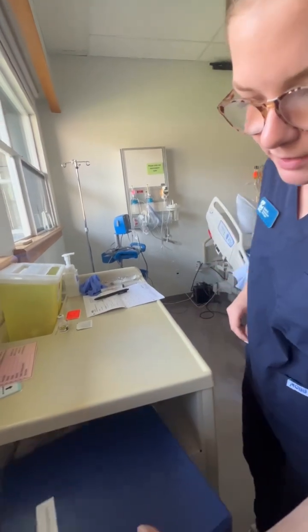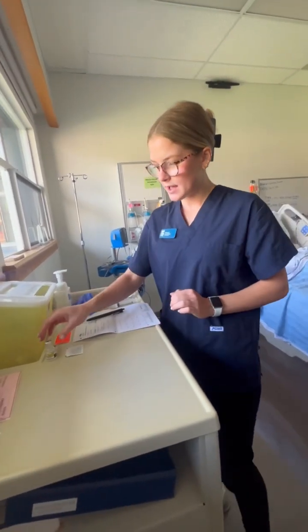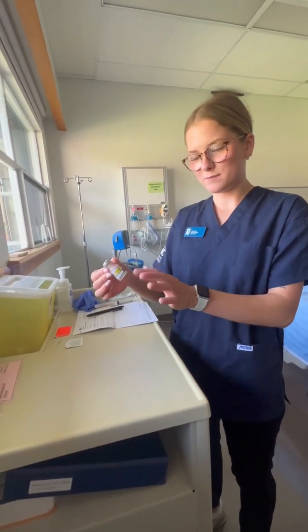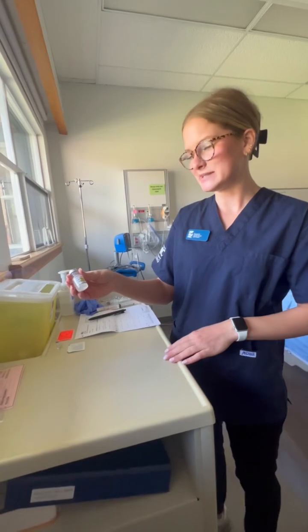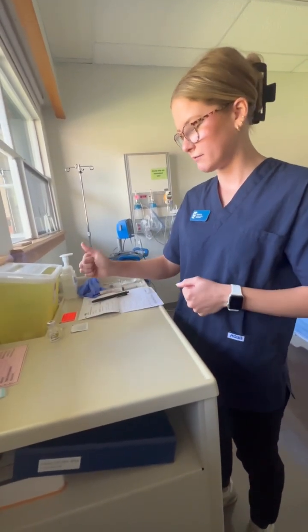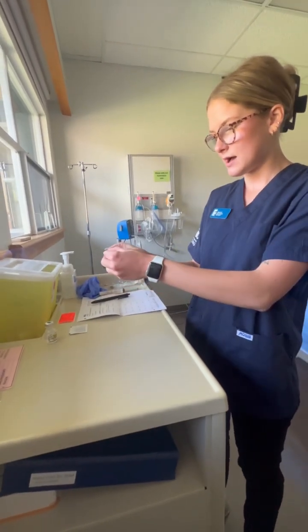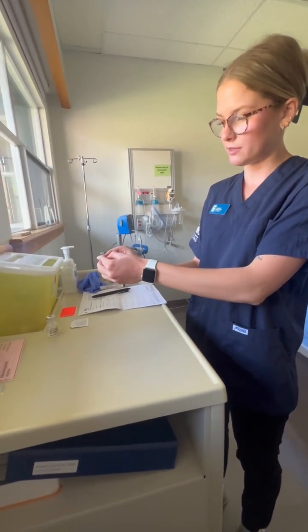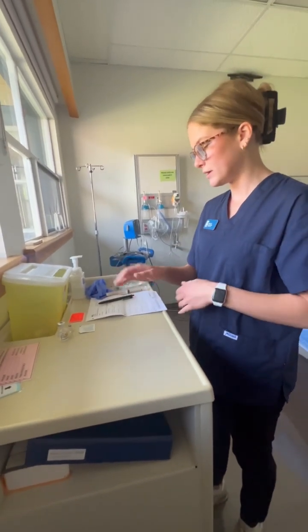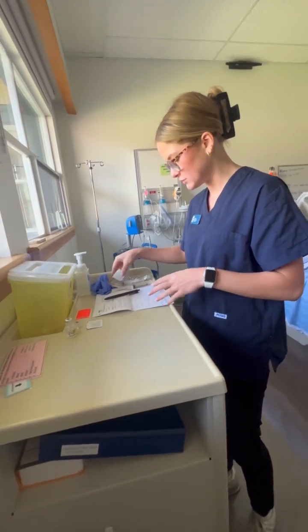All right, so I'm going to perform my first check pulling out the medication here. I have normal saline, expires 2024. I'm making note of that because of video purposes, just with resources. I'm going to use it, but obviously will not use it in a real world situation. And then I also have morphine. It is also 2035, so okay to use. It has already been opened, but due to the uses of this video, I'm going to use it.